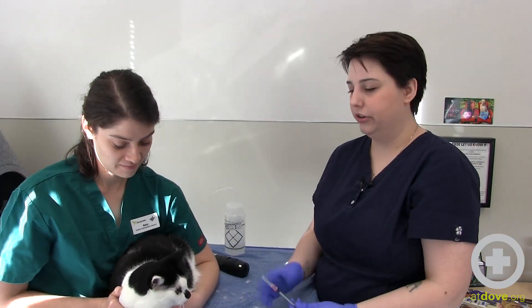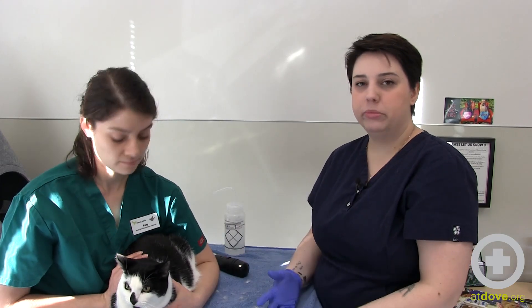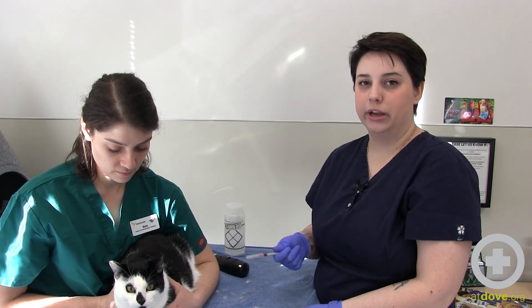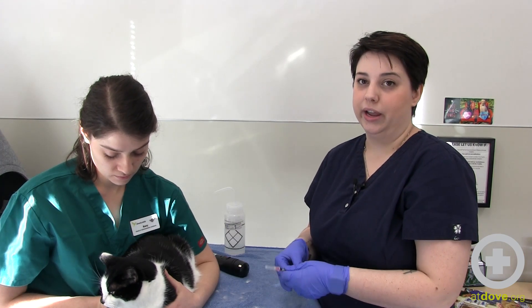Today on Luna we used a 1ml syringe with a 25 gauge needle, but you could draw on a cat with a 3ml syringe with a 21 gauge needle, or you could also use a butterfly syringe. The important thing to remember when drawing on a cat is to draw back slowly, because you don't want to collapse the vein or damage the red blood cells as you are doing it.